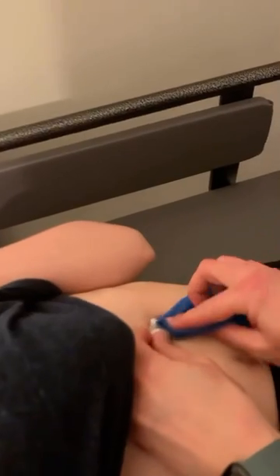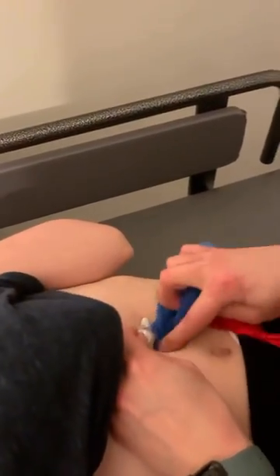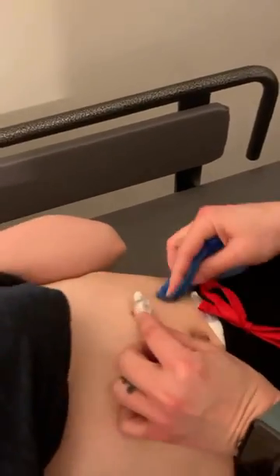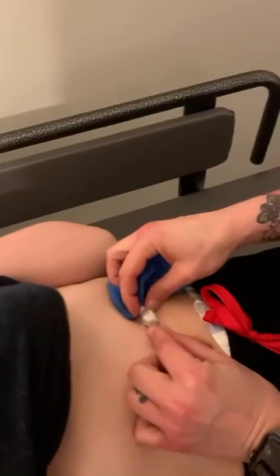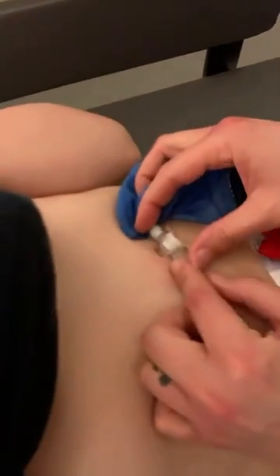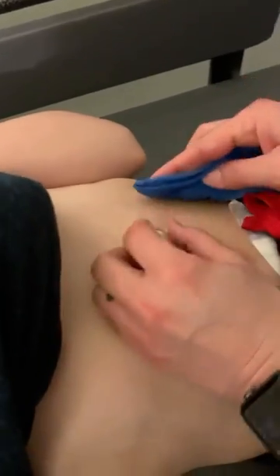So we're just going to wipe underneath, make sure, and we're looking at it at the same time to make sure that there's no redness. The site looks good, see? Don't pull the Mickey too hard, but you can gently move it and twist it around.